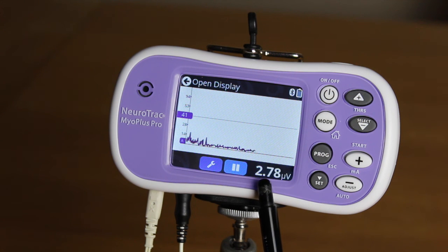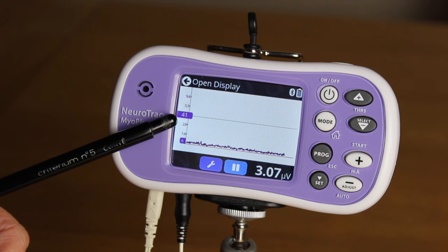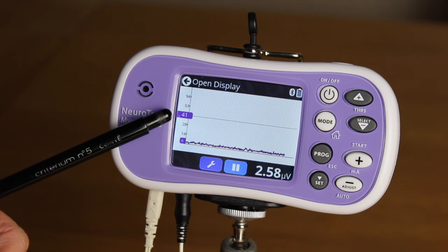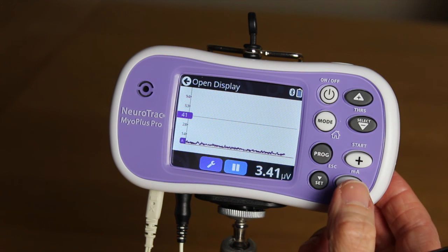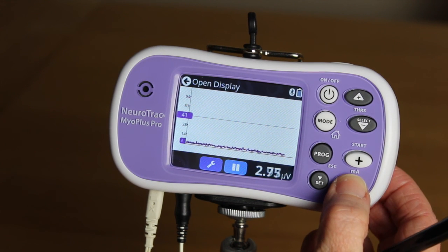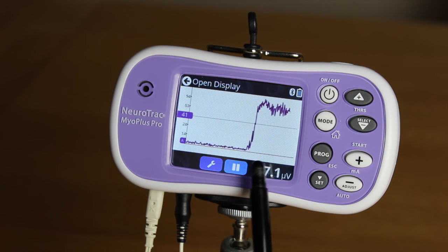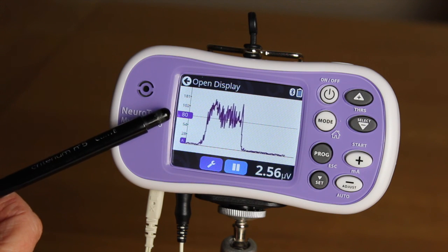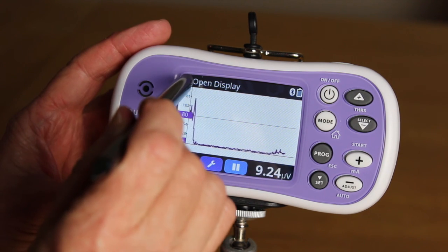Firstly, can the muscle relax and release so the background reading is below 4 microvolts? We want to assess the EMG threshold so the unit scale can be set appropriately depending on the muscle strength. The easiest way is to use the automatic function. Press the auto adjust button and the threshold number will flash. Contract the muscle as hard as possible for three seconds. The threshold level will be set at 80% of the maximum calculated average during the three-second hold.